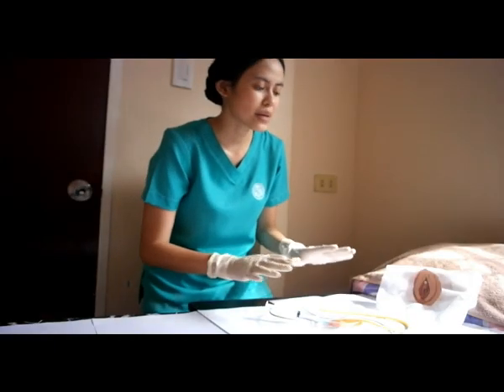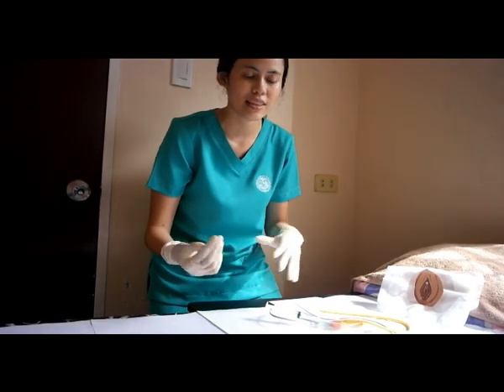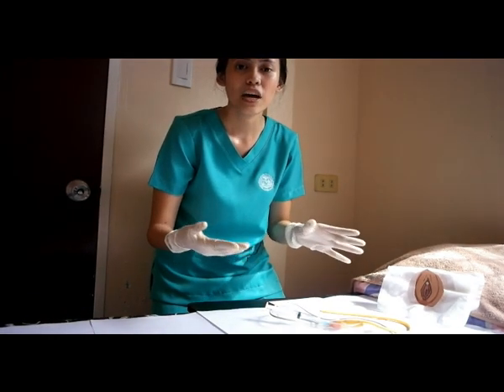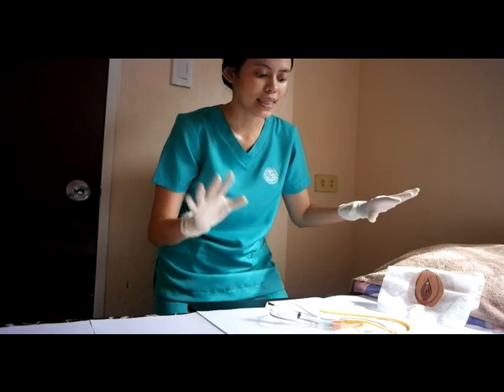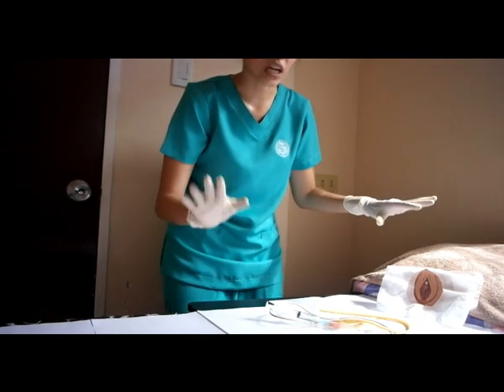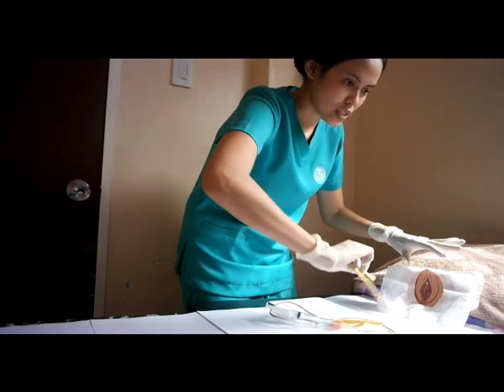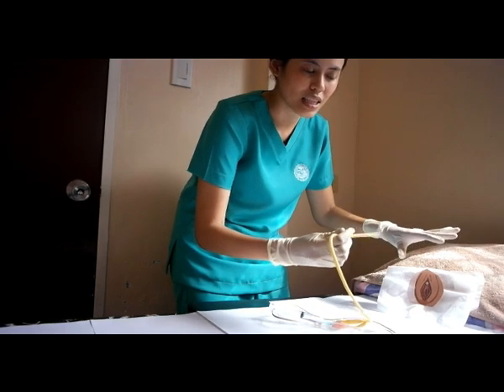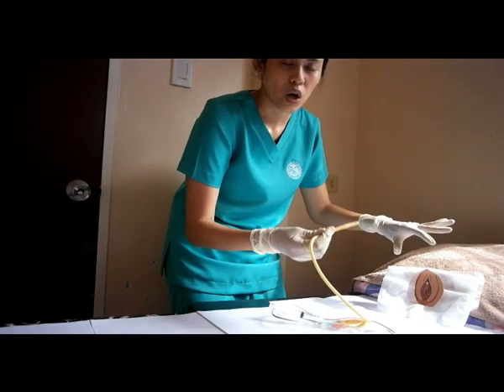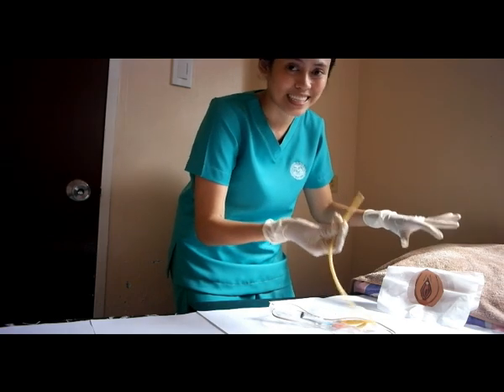So after cleansing the meatus, we will now proceed with the insertion of the catheter, and I will just want to mention that the size of the catheter for female is French 12 to 14, and the length of the insertion should be around 3 to 4 inches. So I will start with holding the catheter as if I'm holding a pen. And ideally, the tip of the catheter should be coated with lubricant. But since I don't have one, let's just say that I already did.